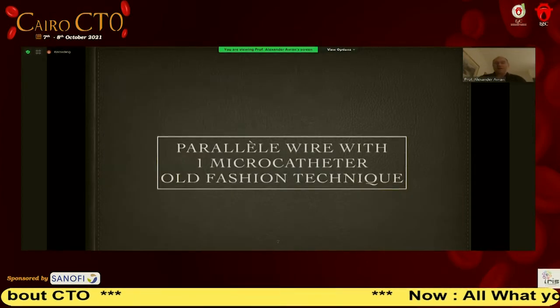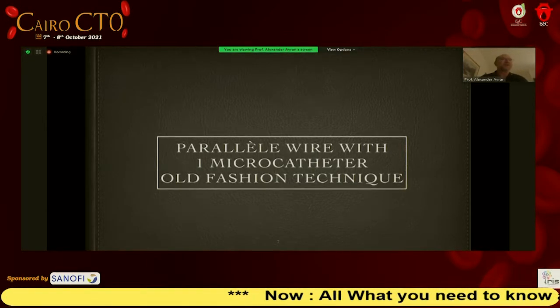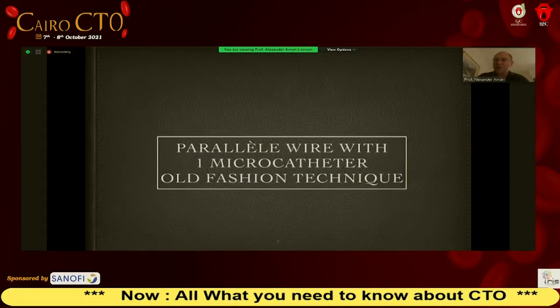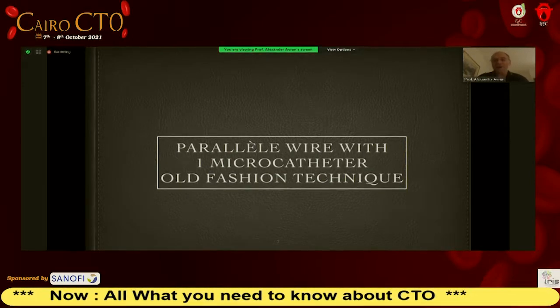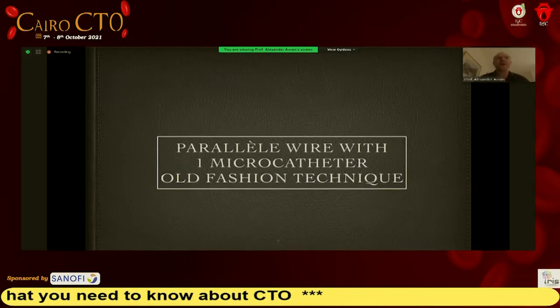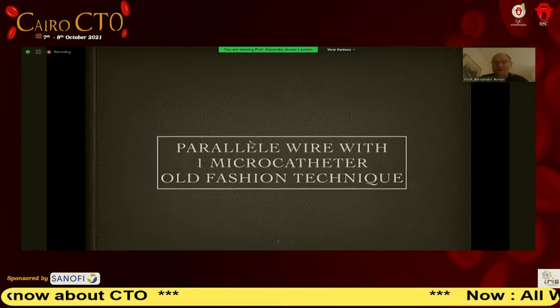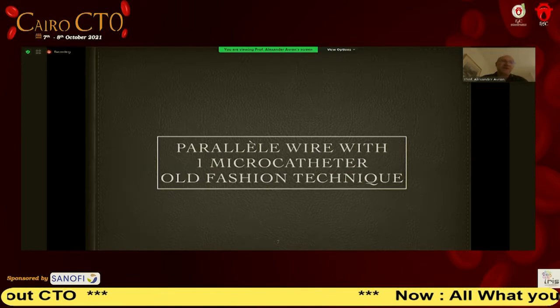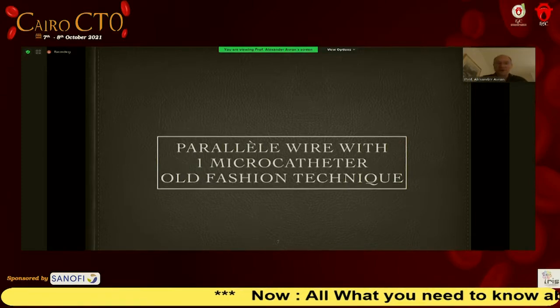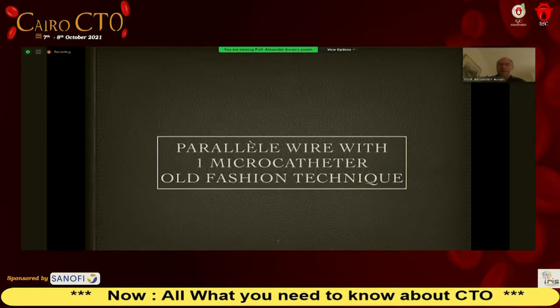The second approach after the wiring, the antegrade wire escalation or antegrade wire de-escalation, depending on what you want to do, is the parallel wire technique. This technique is still very important. I know that some operators don't like this technique, and some of them tell me that they have never done it again, but I'm still working with this technique, and my success rates are very, very high with the parallel wire technique.